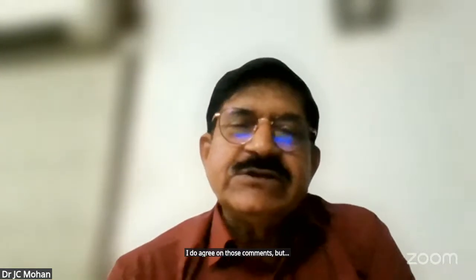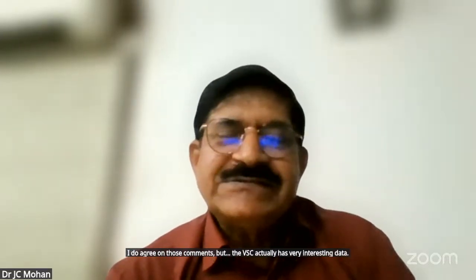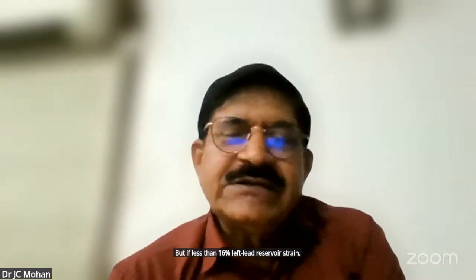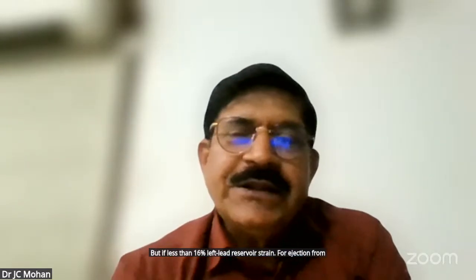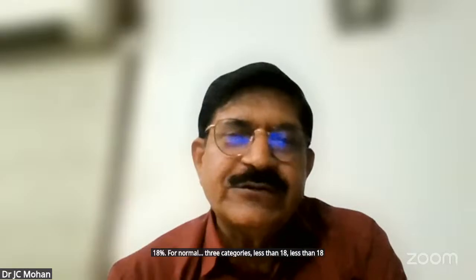I do agree with those comments, but the BSE actually has very interesting data. For AF, less than 16% left atrial reservoir strain. For ejection fraction less than 50%, 18%. For normal, three categories: less than 18, 18 to 24, more than 24.